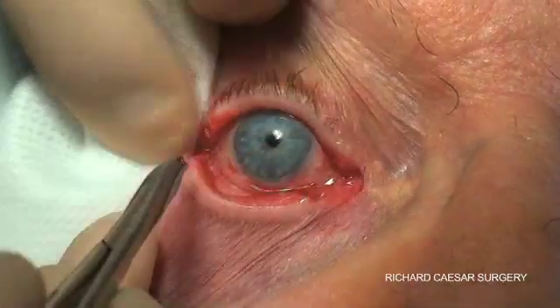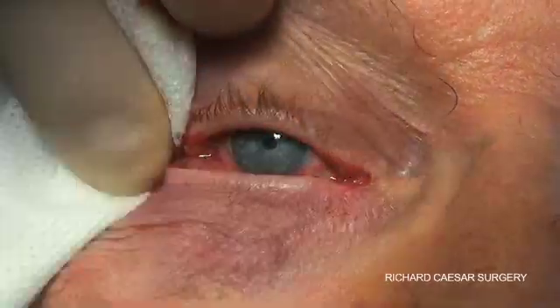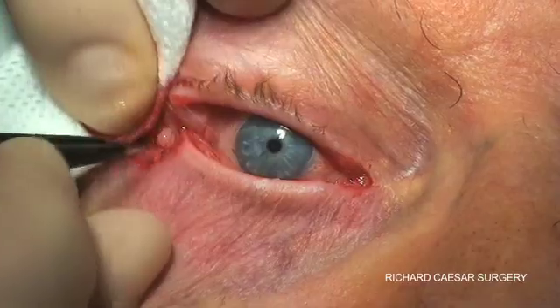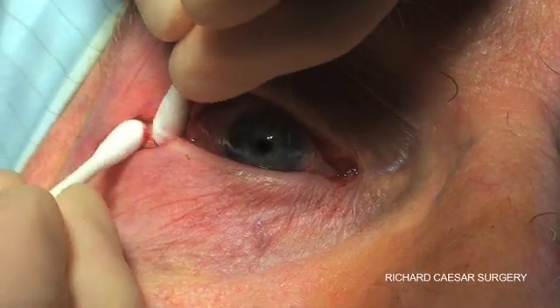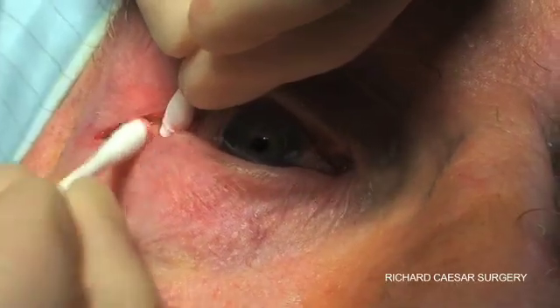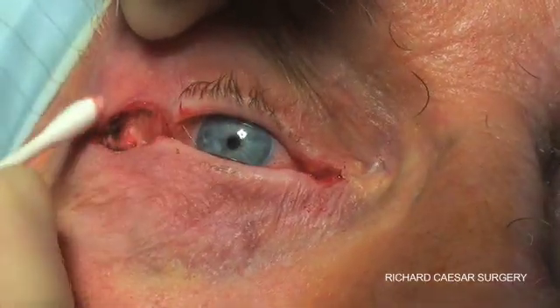Once the rim is reached, you cauterise to get a good view and then expose the rim. One nice technique is to take two cotton buds, pop one inside the rim, one outside the rim, and simply stretch the tissues over the rim so there's absolutely no doubt about where you're going to anchor your sutures.